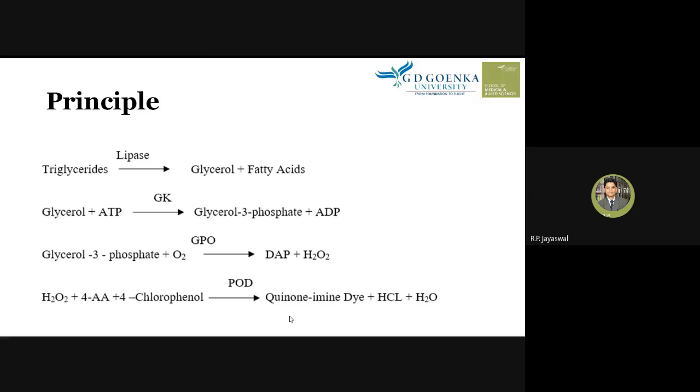Let's know the principle of the test. The test we are doing here is an enzymatic test. So this is the principle behind doing this test. We have represented the principle here in the form of a chemical equation, enzymatic reactions, right? So you can see the triglycerides.